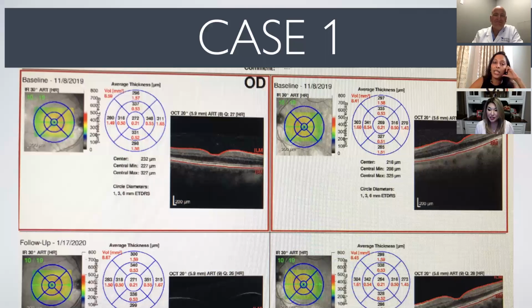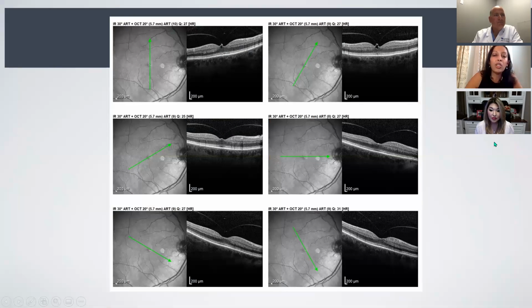So this was an interesting case to me because this is what the picture came out. Our EMR system with the images was not working that well, so they sent down this paper copy, and I was like, my retina colleagues have always said one cut is not enough. And so when you go to the next slide, please, when you actually go to the images and you do multiple cuts, take a look.